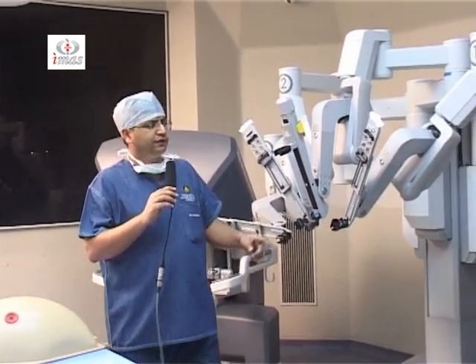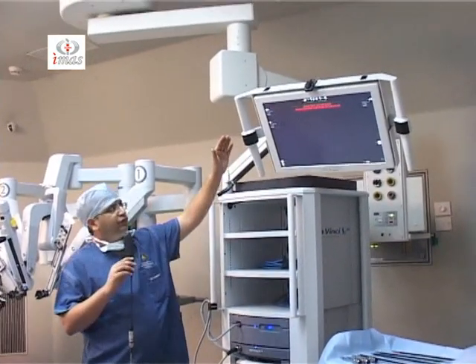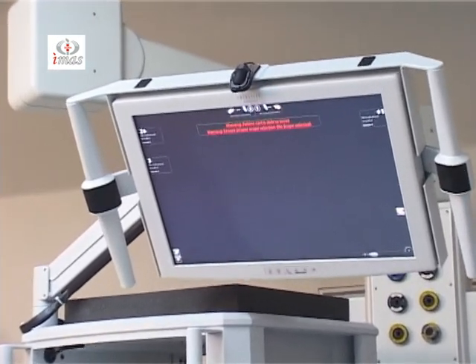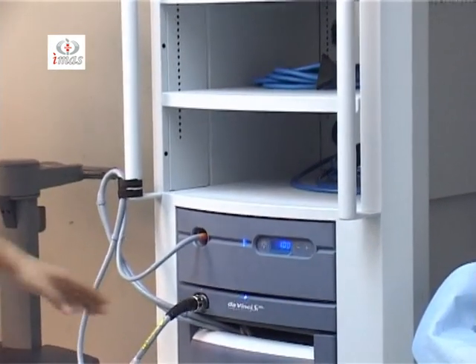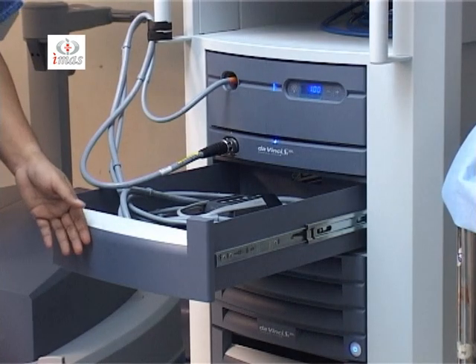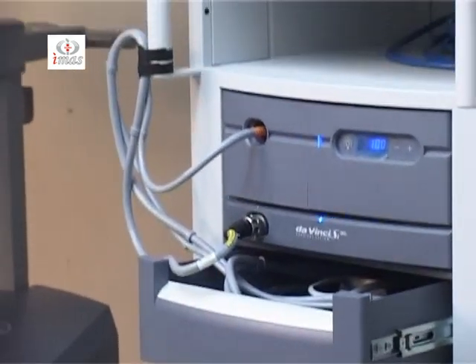And the third part is the vision cart, in which there is a two-dimensional LCD screen on which the assistants and other people can see whatsoever surgery is going on. It contains the illuminator, the camera control units. This is the box for keeping the camera head, which is a dual camera or a three-dimensional stereoscopic camera. So we'll come to different parts one by one.